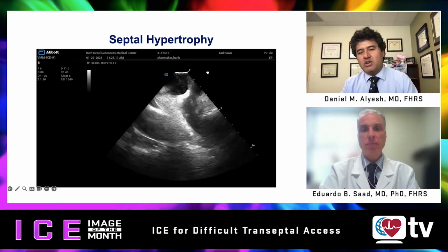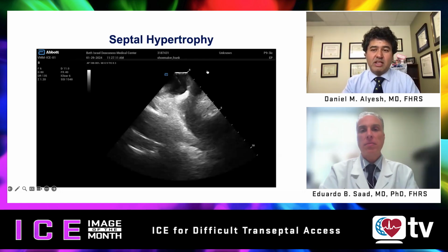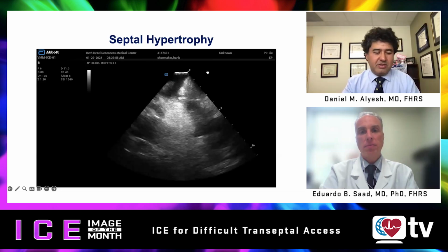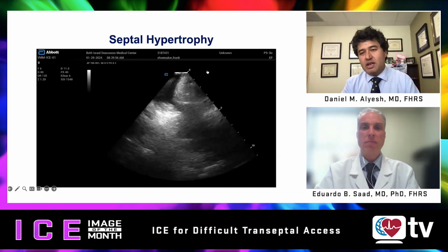And Eduardo, I think that you have a very unique perspective, right? As someone that practices in 2 different environments, a fluoroless, high ICE-heavy operator.